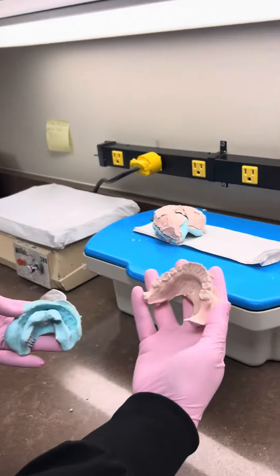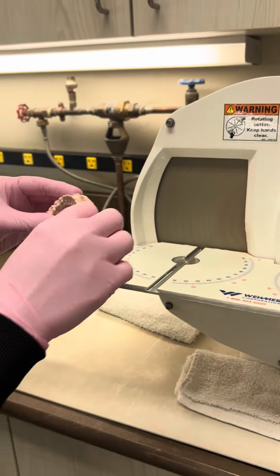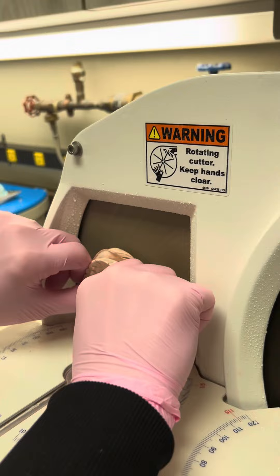So the mold is set. It comes out with a thin blade — it's got water on it. Keep it cool.